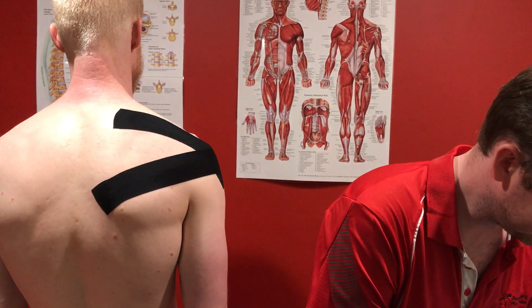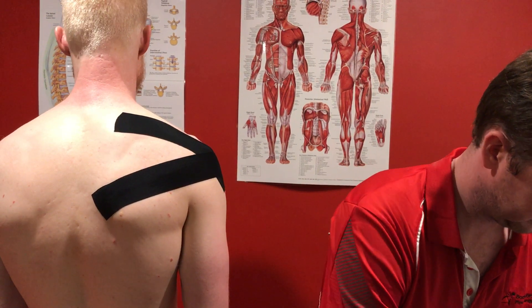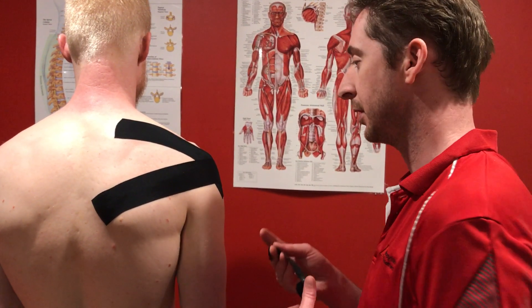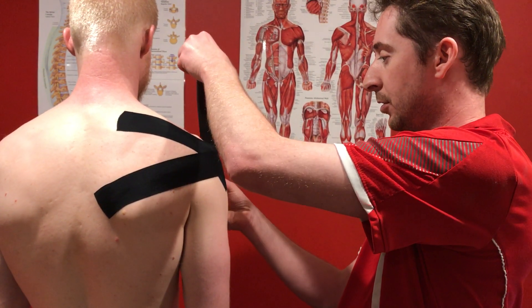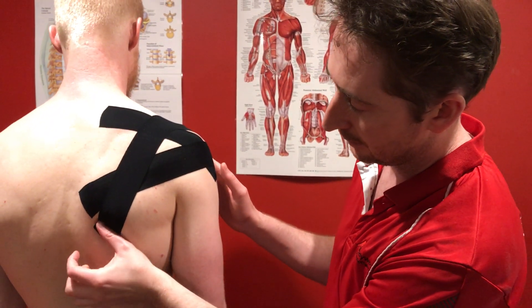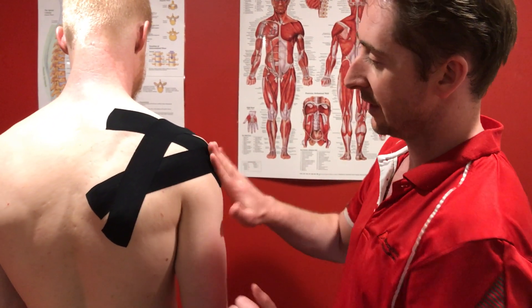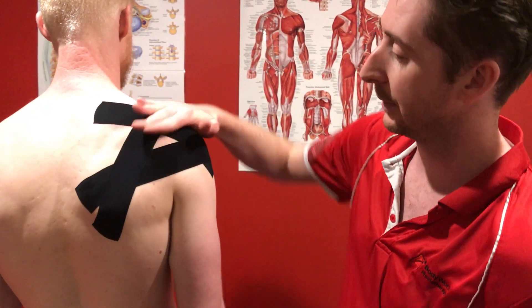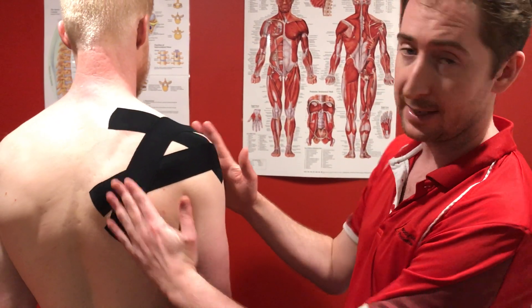And our last one, to try and encourage a posterior hold of the shoulder, is coming from the front of the shoulder, stretching it down across the top, down through there. So you end up with one across through the middle, one going down on an angle, and one coming up and over to hold the shoulder blade down and back.